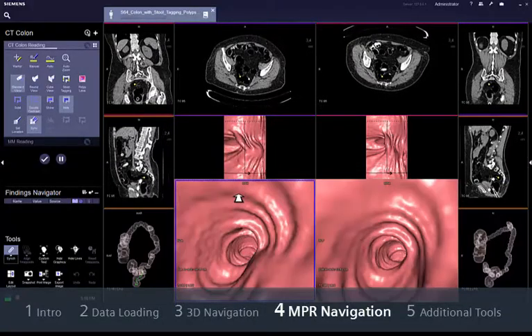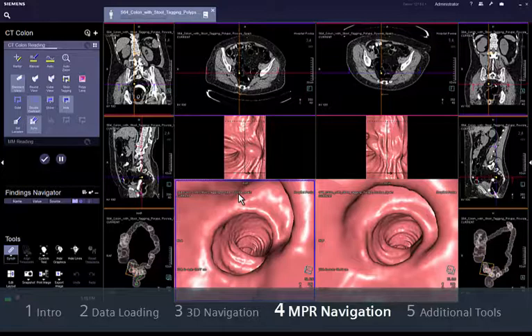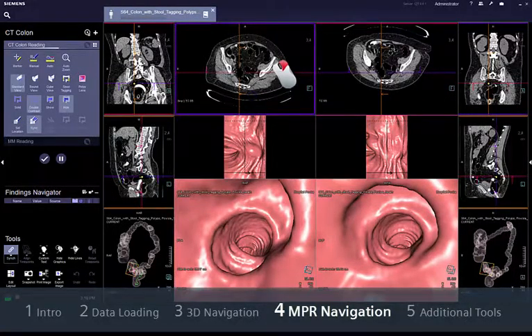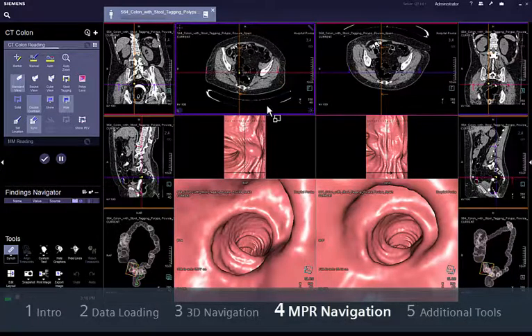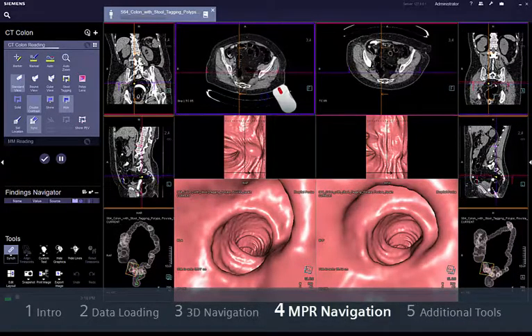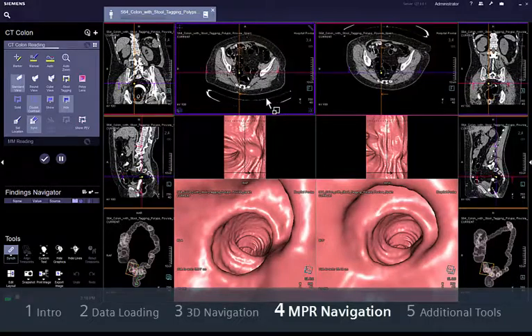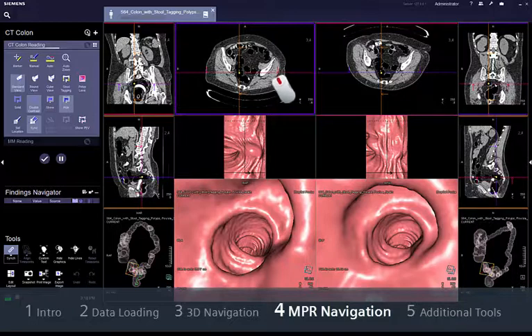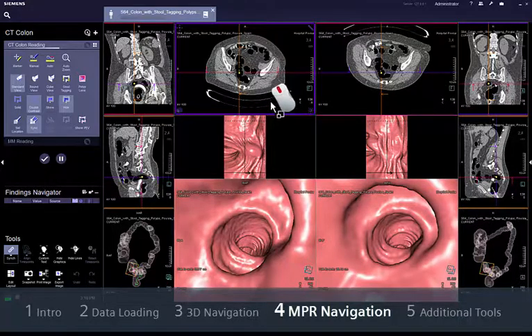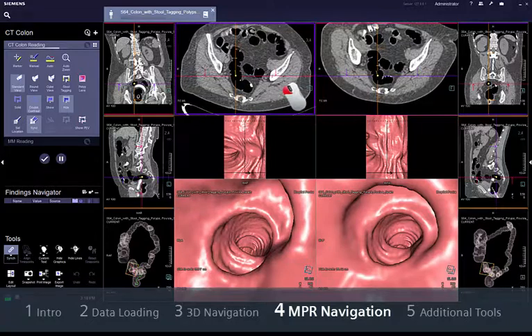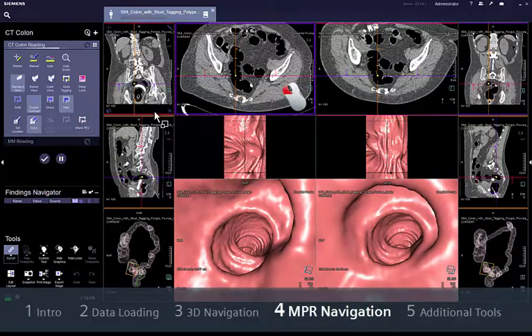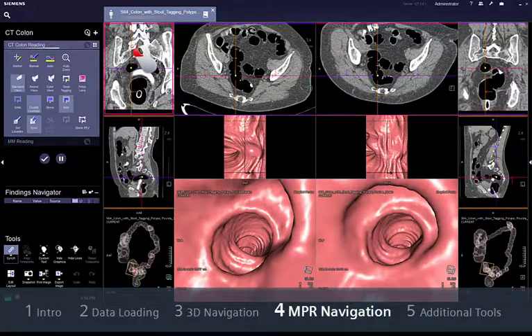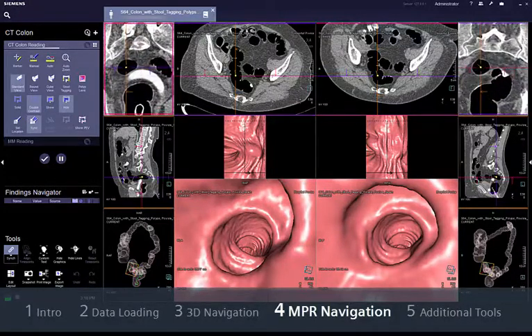MPR segments are also synchronised to display the lumen of the colon in the same position. You can navigate by dragging the right mouse button vertically or scrolling the mouse wheel. Window corrections can be done by dragging the middle mouse button vertically and horizontally. The left mouse button allows you to zoom when the cursor is in the periphery of the segment, or to pan when the cursor is in the centre.